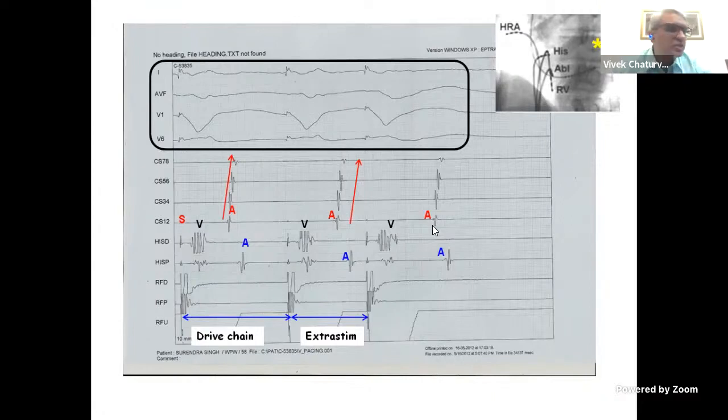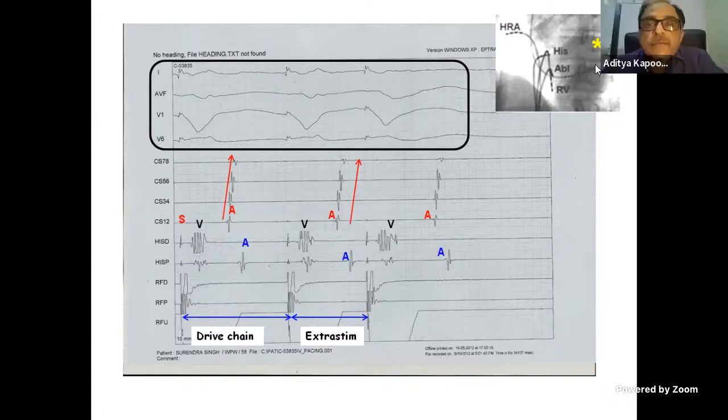Just one small thing. All these tracings are almost like a computer: you only get the information which you are feeding into it. So the A is earliest in 1, 2. But do remember that the pathway could actually be even further up. We are not there, so we haven't got that information. But what we have conclusively succeeded in proving is that there is eccentric conduction. So there is probably an accessory pathway somewhere on the mitral annulus. That's a great point.